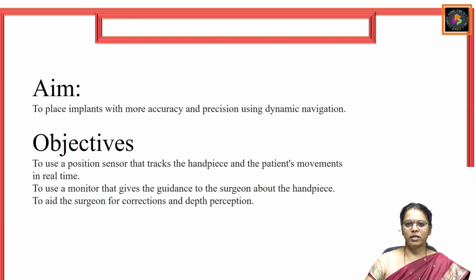Main aim of the study is to implant the dental implants with more accuracy and precision by dynamically visualizing the operation site and calculating the error, which in turn helps the dental surgeons to minimize the errors in the implantation surgery.